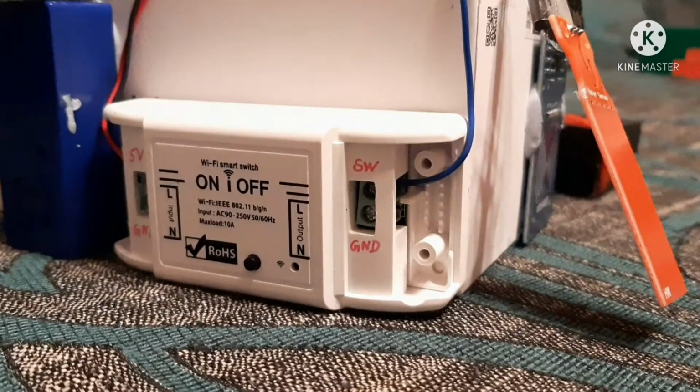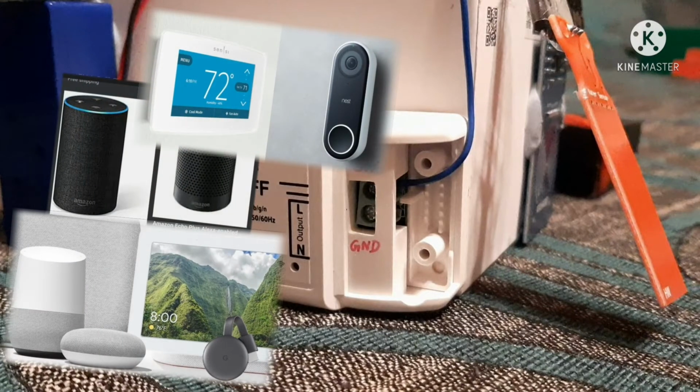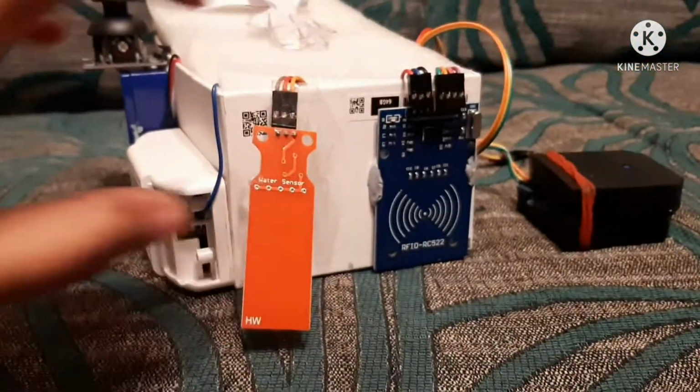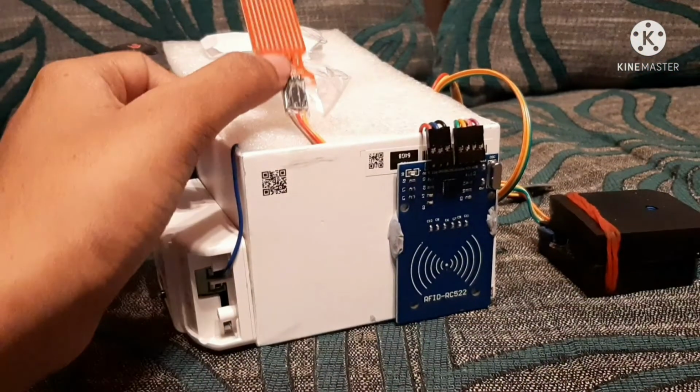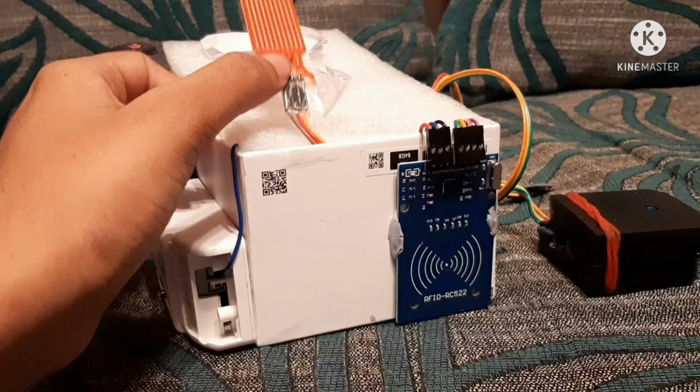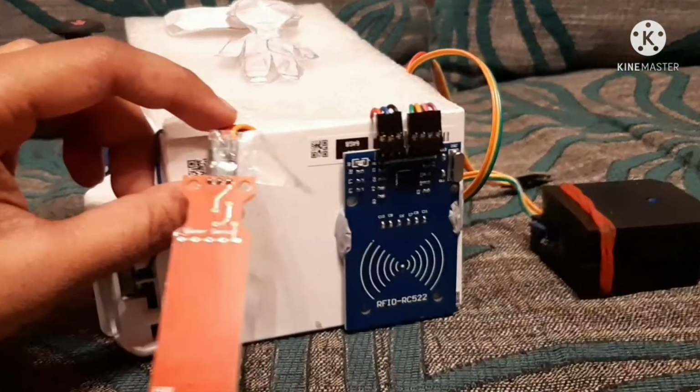Over here is the Wi-Fi switch which triggers the help indicator LED. The Wi-Fi switch can be controlled by any smart home devices or smart home apps. The moist sensor at the bottom side of the bed will be designed on a flexible PCB board in real life and will be inserted in the patient's incontinent brief.